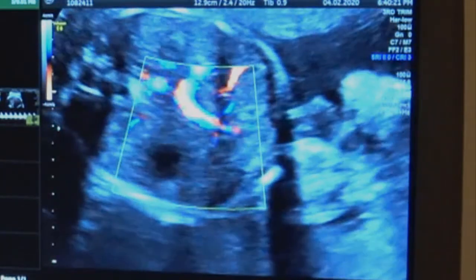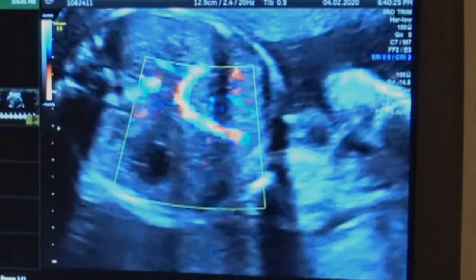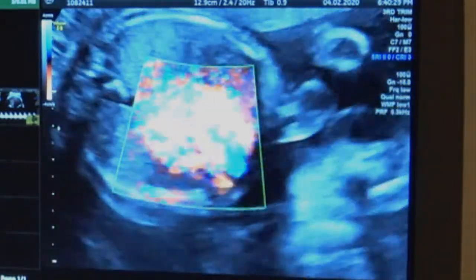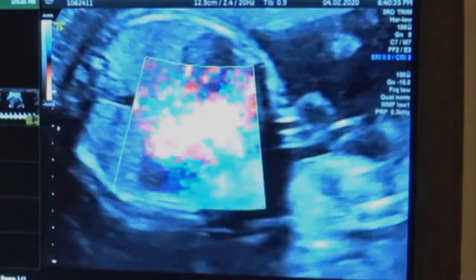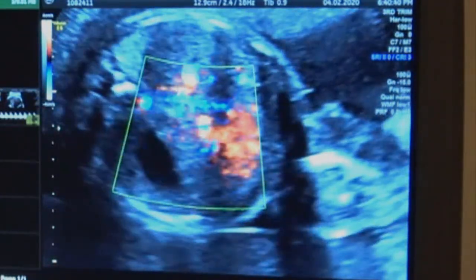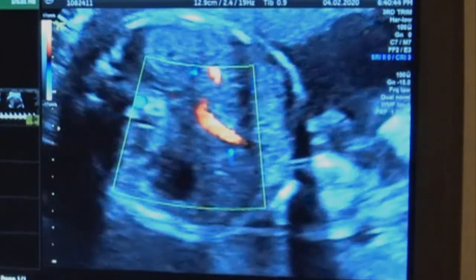I am moving higher. Oh, no, sorry, that makes sense. Of course you go up, because stomach. It's a bit too messy, sorry. Just increasing the PRF now. So stomach there.